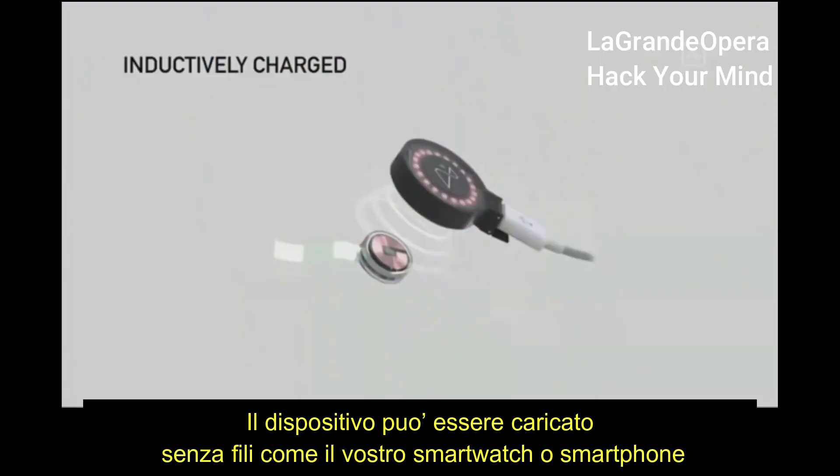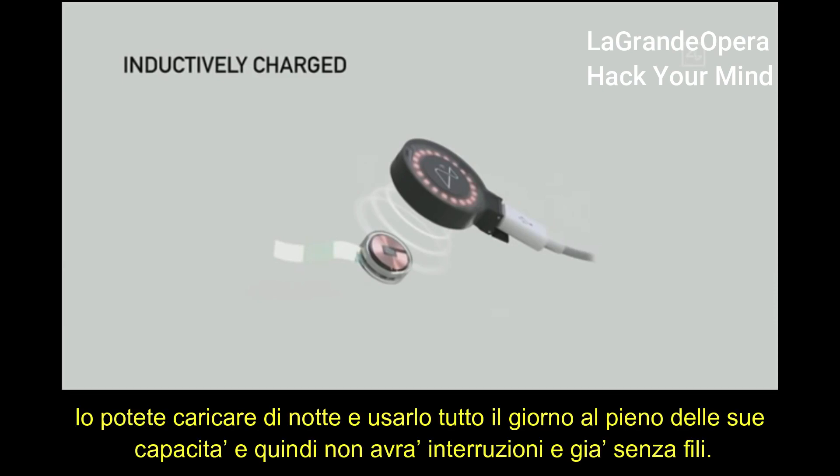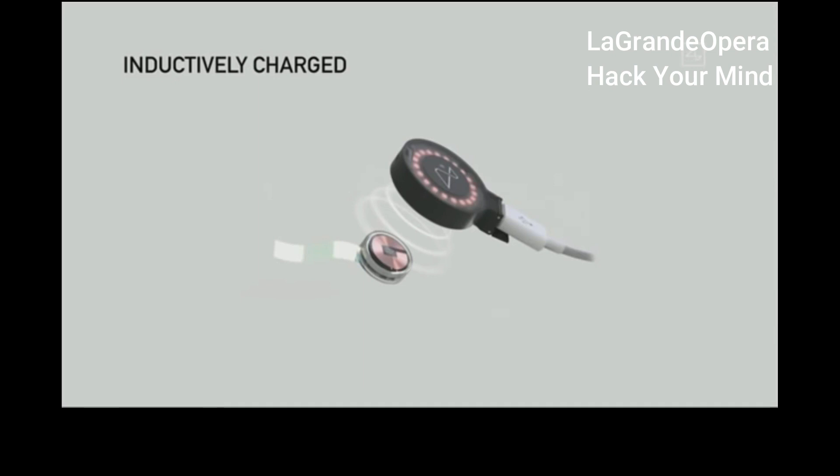It's also inductively charged — charged in the same way that you charge a smartwatch or a phone. You can use it all day, charge it at night, and have full functionality. It would be completely seamless. No wires.